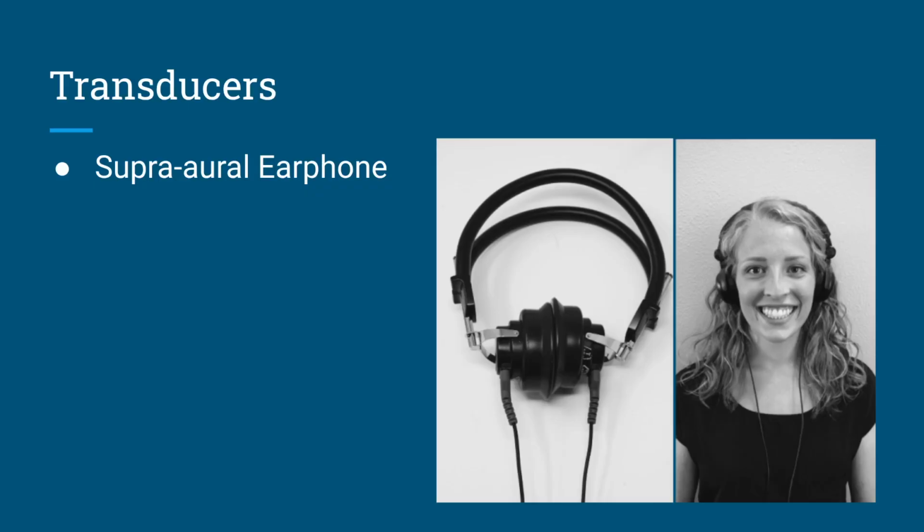It's still used in some situations, like narrow older adult ear canals where an insert foam tip is causing a low frequency air-bone gap artifactually, and greater output is needed than an insert can provide. It's a better choice for TM perforations due to a more accurate representation of the audiogram.